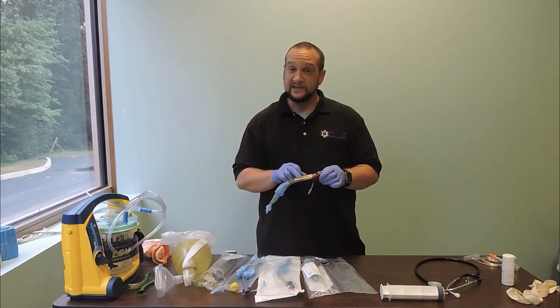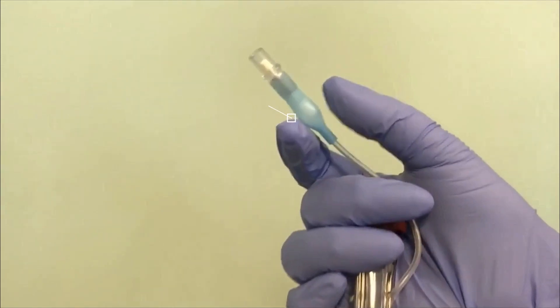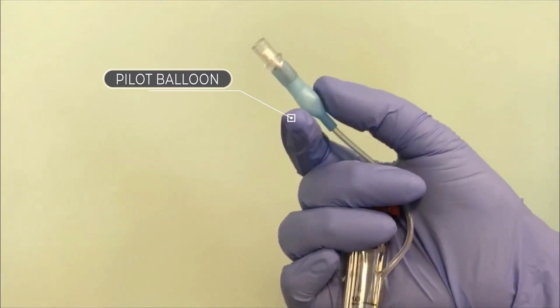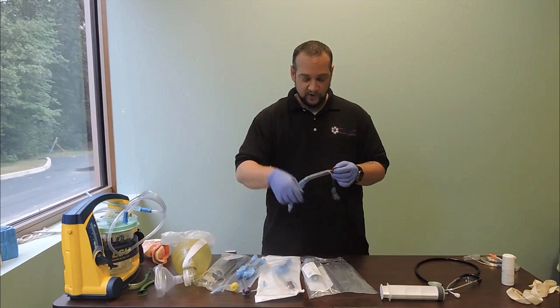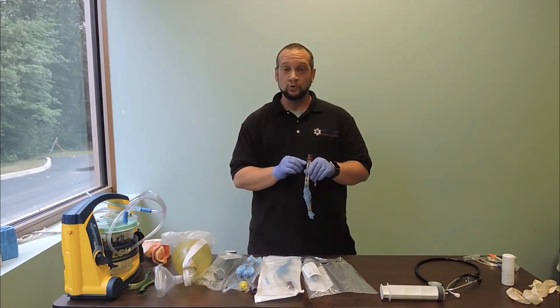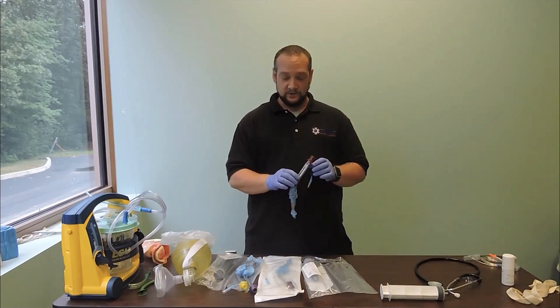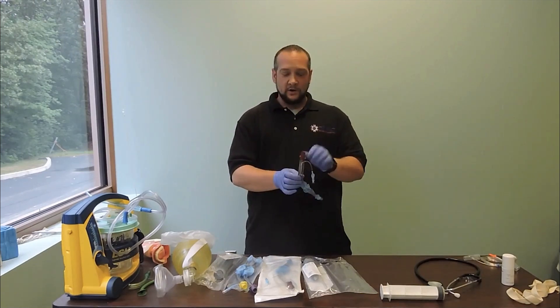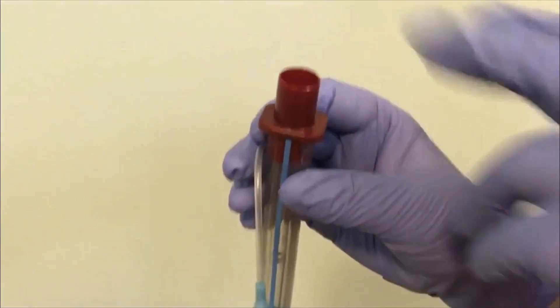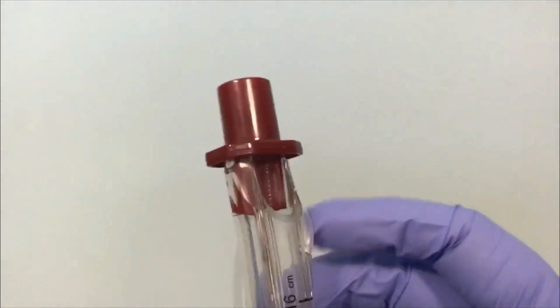We have our teeth lines measured out in centimeters. This here is our pilot balloon — this is where we attach our syringe using the luer lock to fill our cuffs with air. This port allows us to insert our OG tube to decompress the stomach and help prevent gastric insufflation. Then we have our universal 15-22 millimeter adapter, which attaches to all of our oxygen delivery devices.